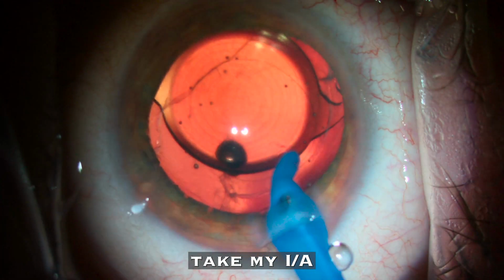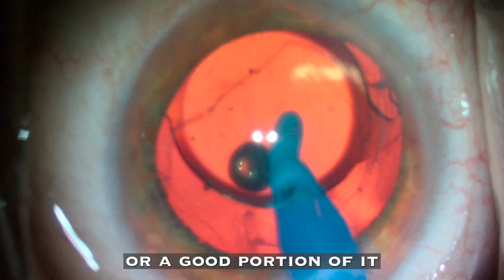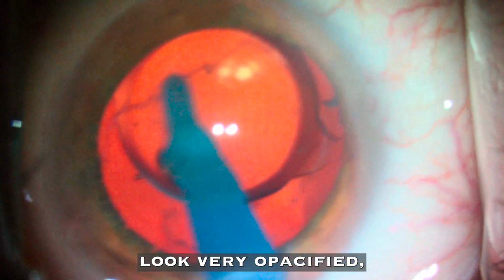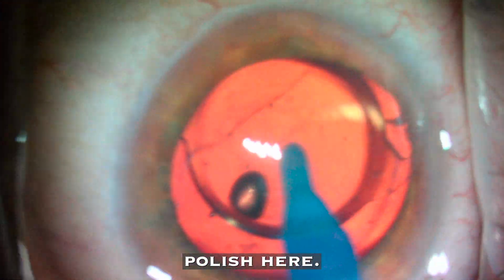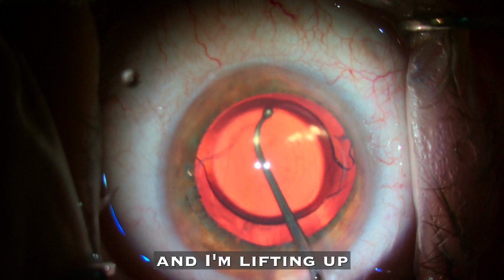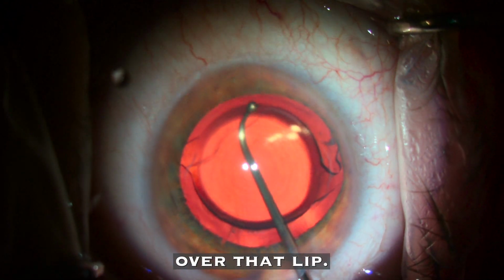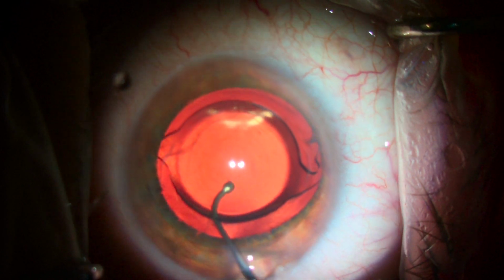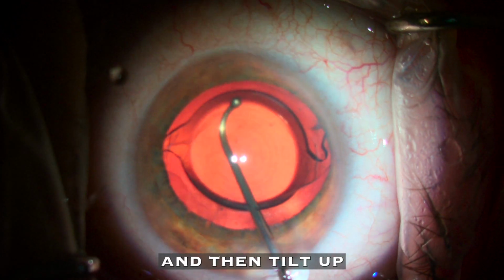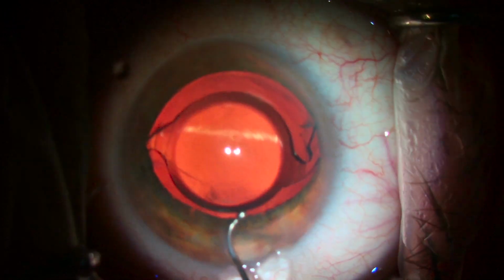While it's flipped up, I'm going to take my I/A and clean up some of the posterior capsule and remove the viscoelastic, or a good portion of it, from behind the lens. The capsule didn't look very opacified, so I did a more conservative polish here. And now I'm taking a Connor wand and I'm lifting up the optic edge and easing it towards me to get it up over that lip. Okay, I feel pretty confident it's up over that lip. Now I'm going to ease it over and then tilt up the opposite portion of the optic and push it over. And I've done it.